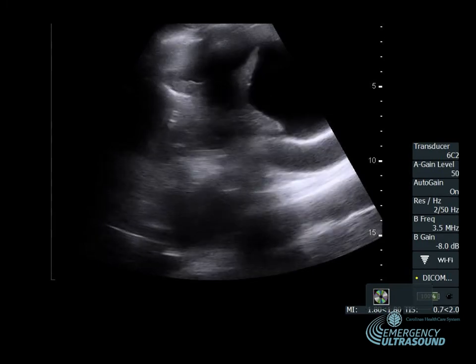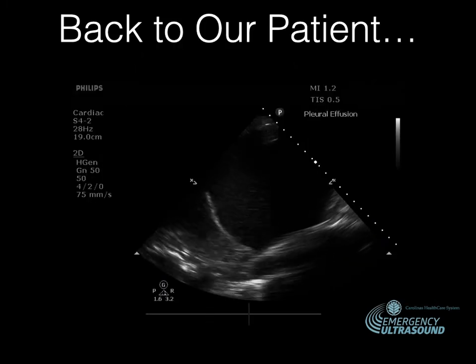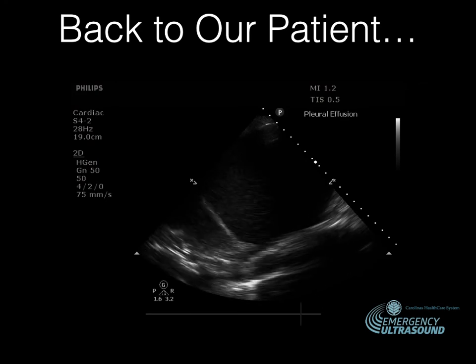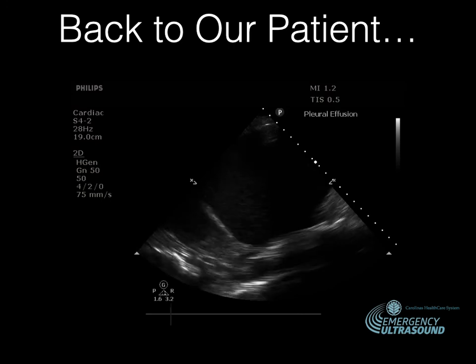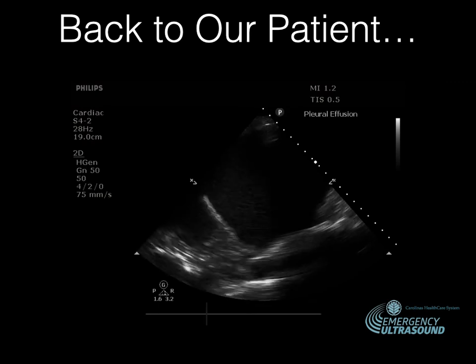the left ventricle here. So going back to our patient, Mrs. B, you're waiting on your portable chest x-ray, so you wheel the ultrasound machine over to the patient and obtain these images. So what are we seeing here? We're looking above the diaphragm, we're seeing this spine sign, we're seeing a lot of anechoic area, and then a little tail of something that's flapping around in the fluid.